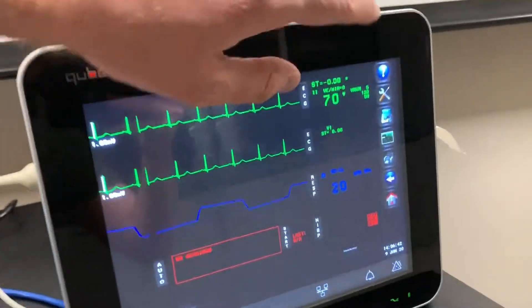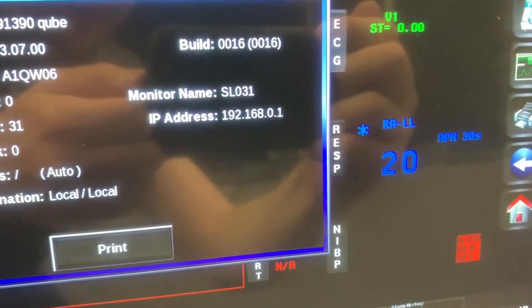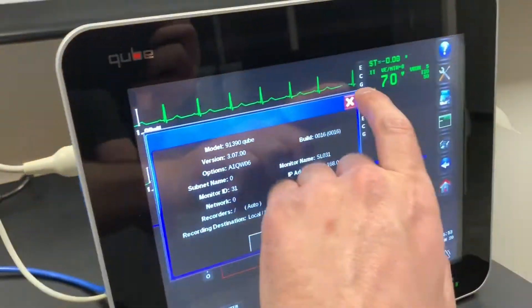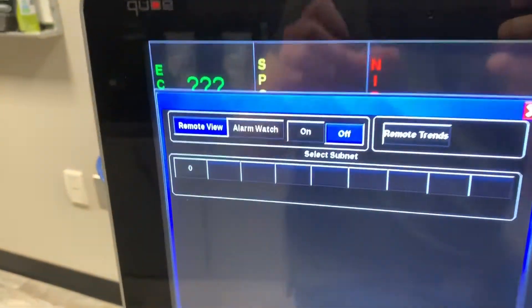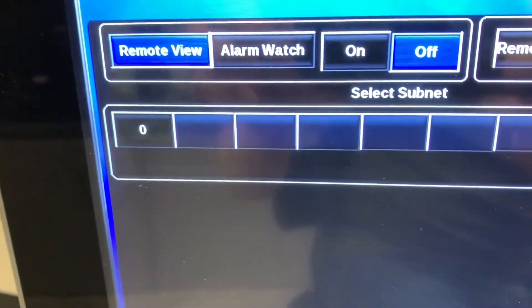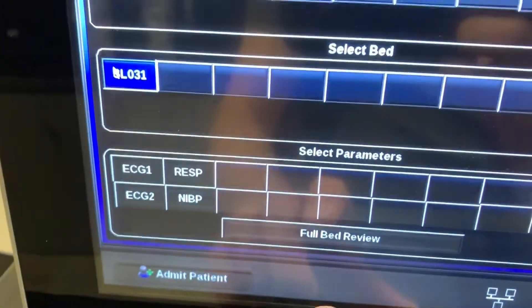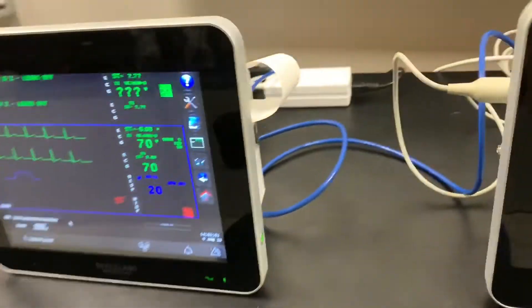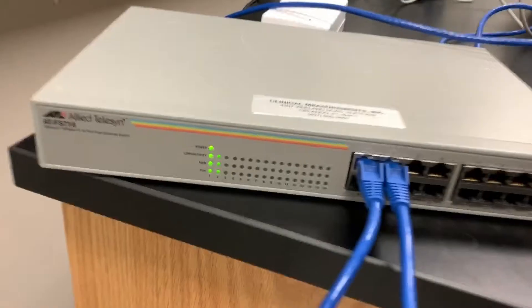Now that networking is set up, we can double-click the question mark up here. You can see this one has the IP address we assigned, and same for this one. So now if we go to remote trends on this machine and click this button, you can see up here we now have a subnet showing up. If we click on that — SL31 — and full bed review, you'll see it populate, and it'll start pulling the trend information from this machine onto this machine. And that's all going through this networking switch here.